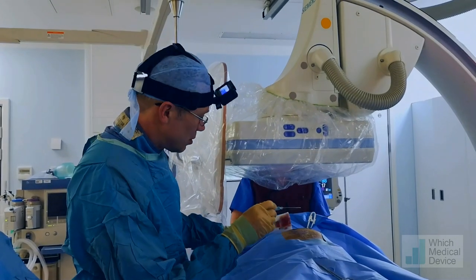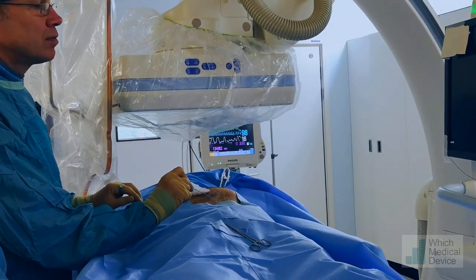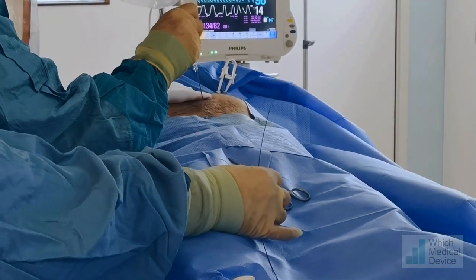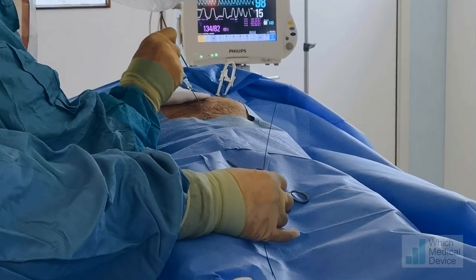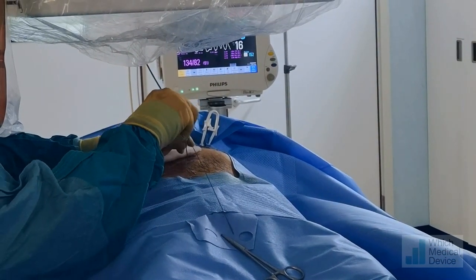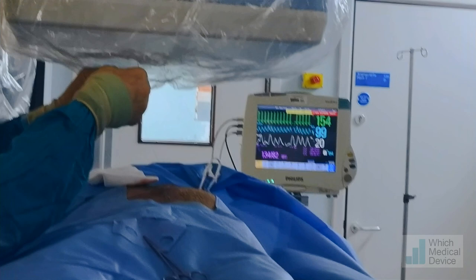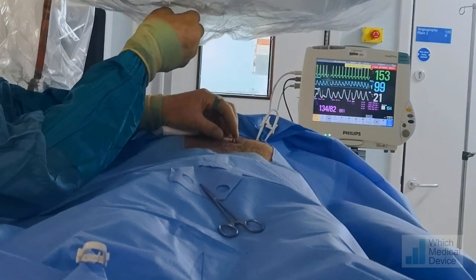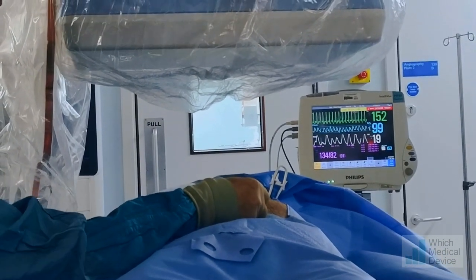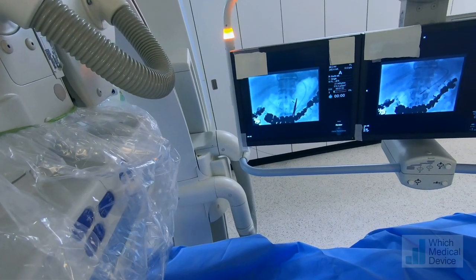That's fine with the air now. We're pushing and sliding that down until we get a little bit of tension, which will hold the stomach in place. I'm checking my other two positions to confirm they're still over the stomach — there's one there and one there. So we'll end up with a gastrostomy position at the top, which will be fine.